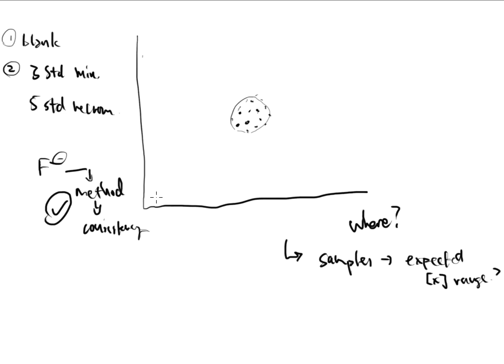So what would happen is that I could do one that's a little low, maybe the second standard that's going to be here, the third standard, the fourth standard, the fifth standard, the sixth standard out here, and the seventh standard up there, if I'm required to do 7.